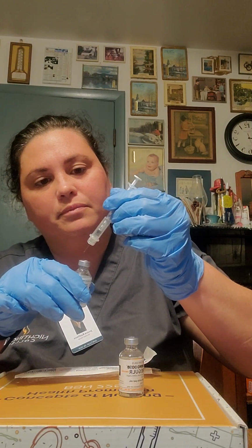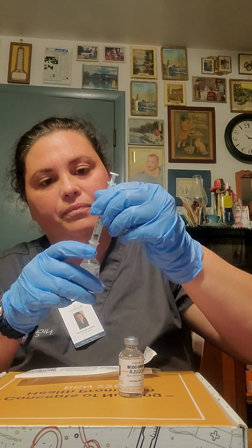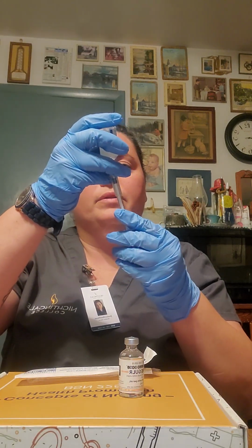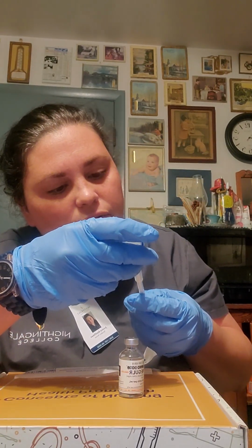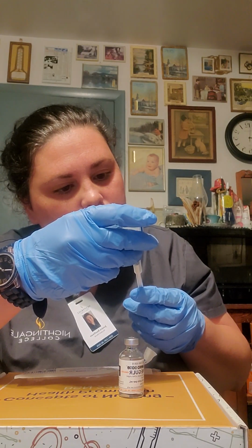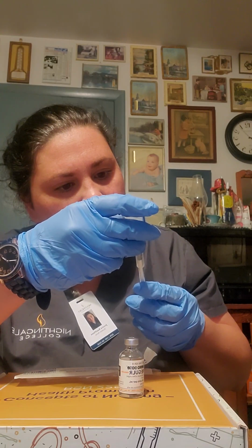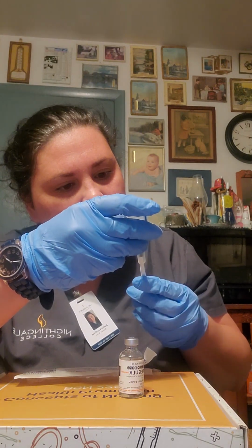Alright. I'm injecting it in here. Going to flip. And I'm going to pull back to 12 units. 6, 7, 10.